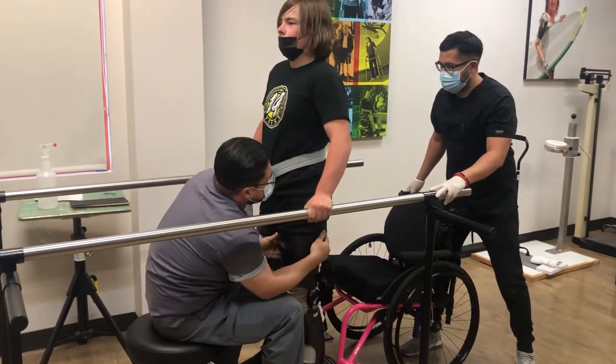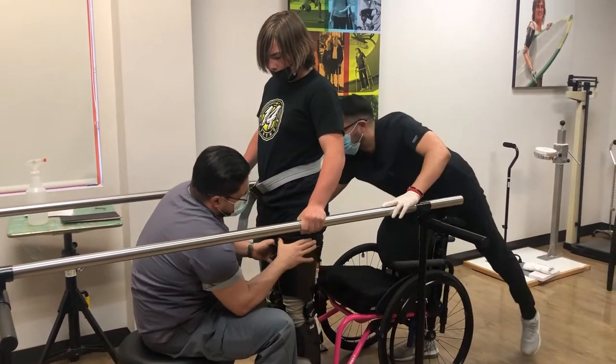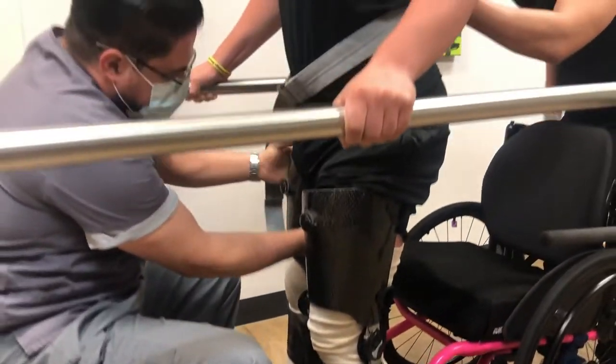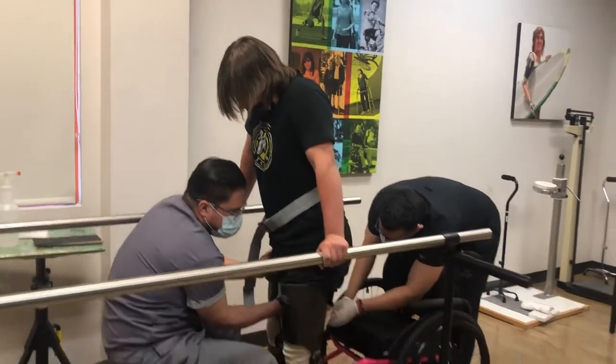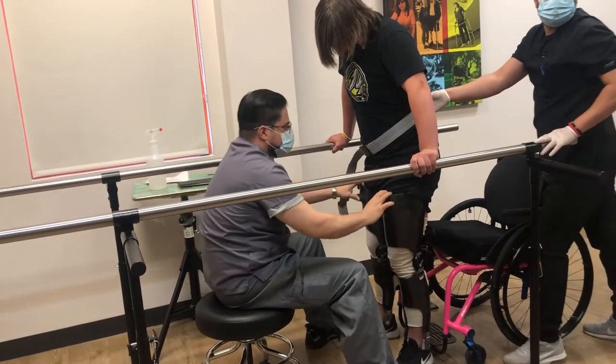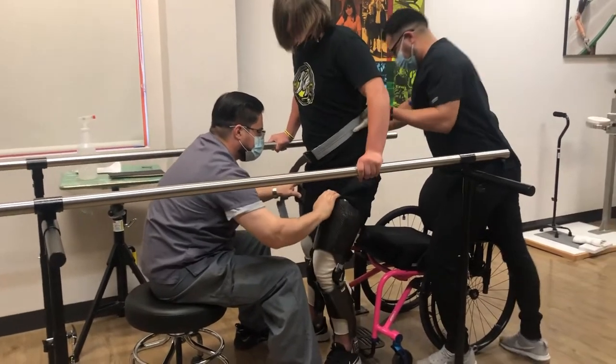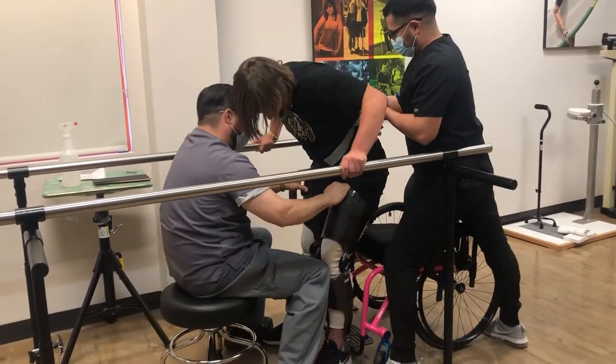See how his tissue fills it in now? Yeah, is there no gap in there? No. Okay, yeah. I would do one and let the other one stretch out — help him stretch that one out. How does it feel? I'm holding your knee here so you don't buckle.